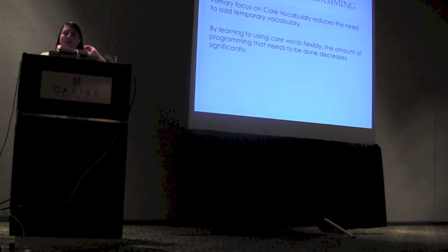By learning to use core vocabulary words flexibly, the amount of programming time that needs to be done decreases significantly, because the vocabulary is already in the device.